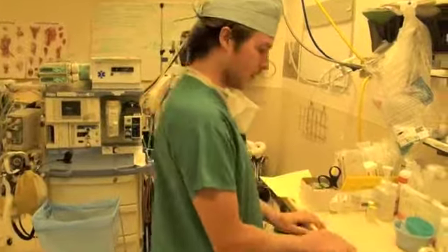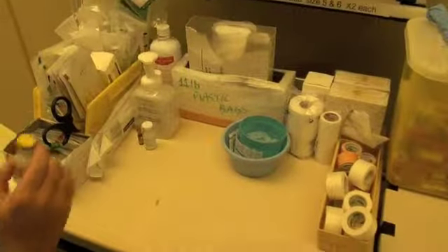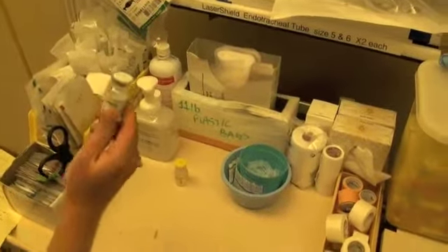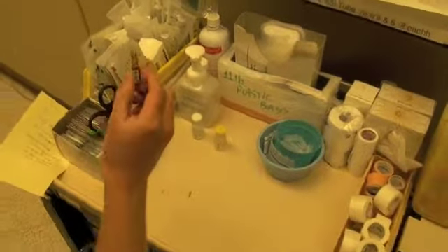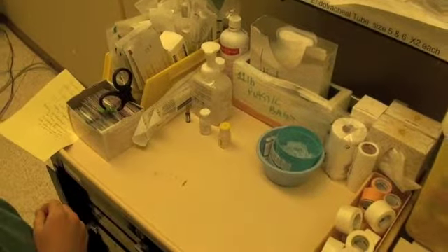We've got a workspace here on top of the anesthetic cart. We're going to be demonstrating three techniques today. One is going to be drawing something straight up into a syringe. Then we're going to use that to dissolve a powdered antibiotic. And then the third technique will be diluting a medication, in this case ephedrine, 1 in 10 into normal saline.